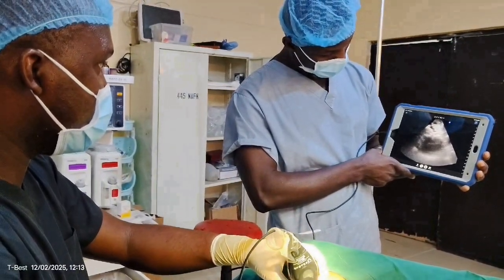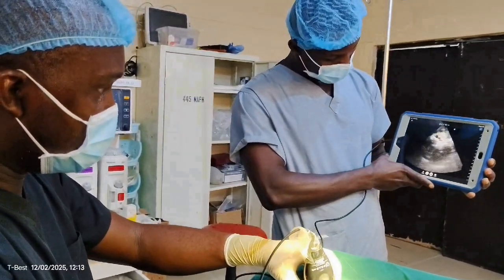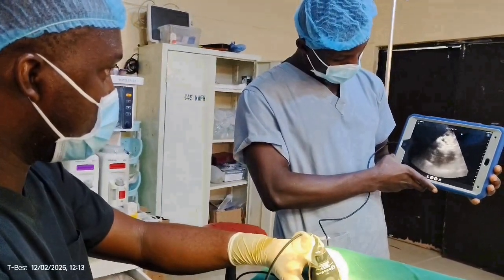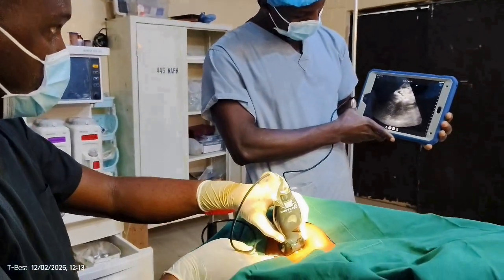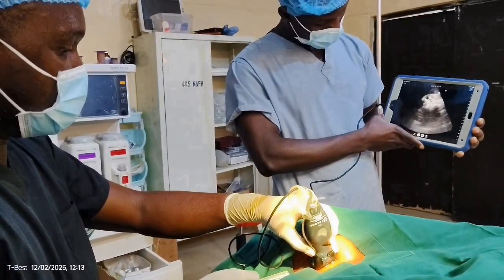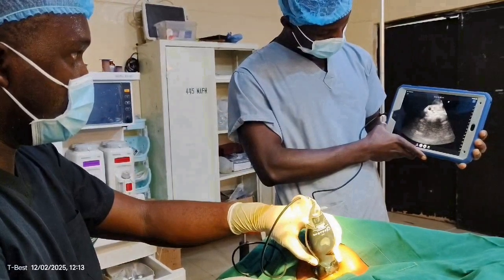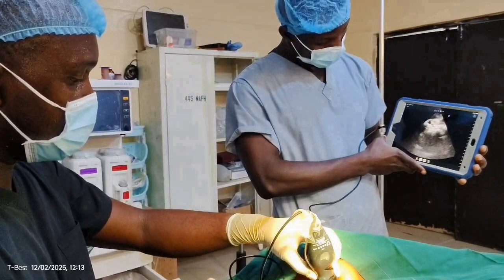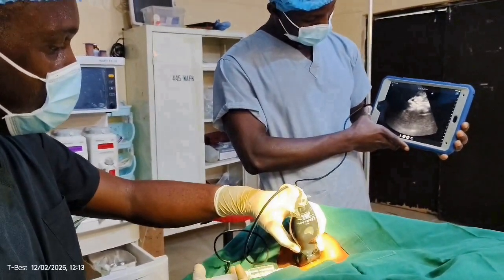You can see my needle. I have to keep the needle in view for you. You can see the needle coming in. Inject one or two mils. That's great — be sure you are now in the best position. That's great.